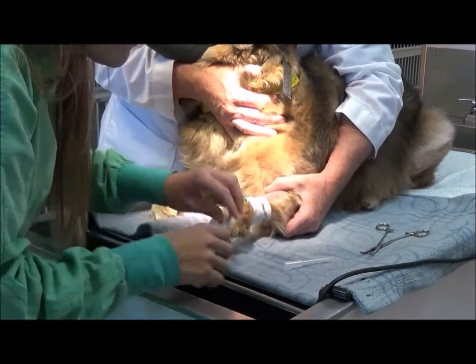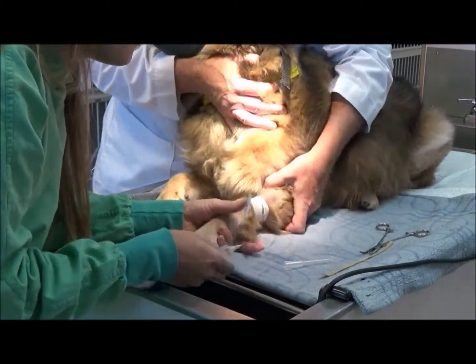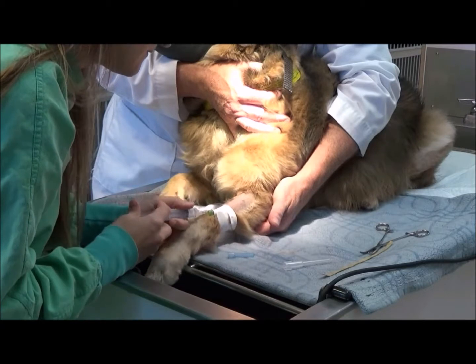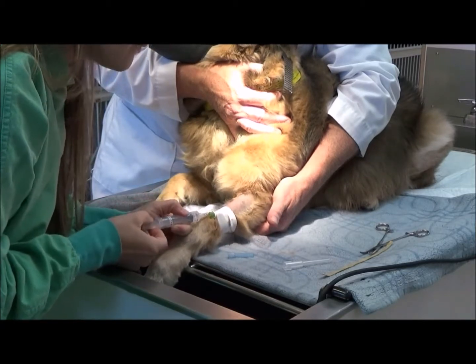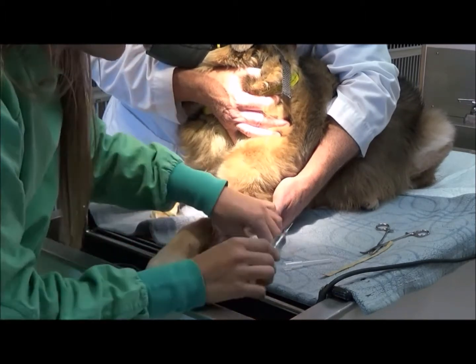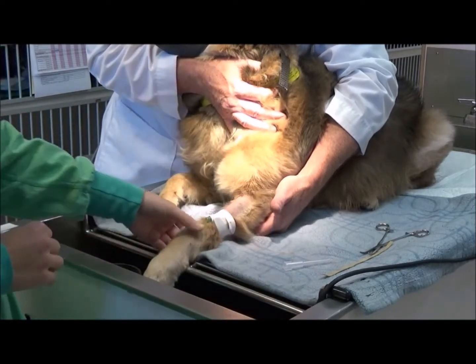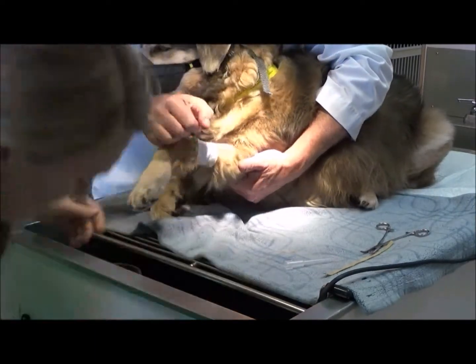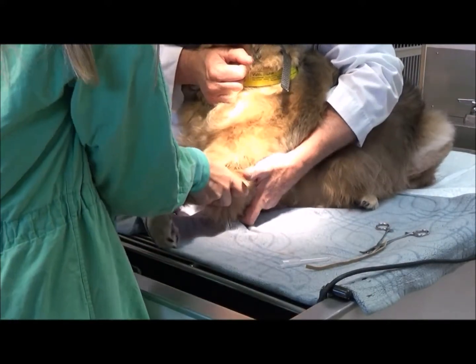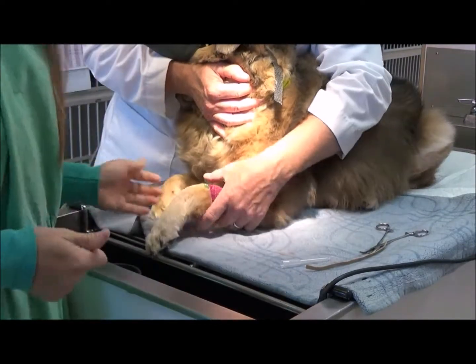And just to be sure we got the catheter in the vein itself, I'm going to flush it with saline here. I'm going to aspirate just to make sure I get blood. Yep. So we're good, and then I'll just put a piece of that wrap over top. There we go. And we're good.